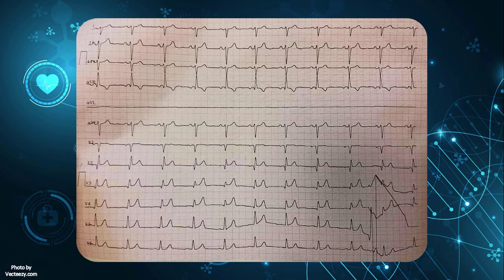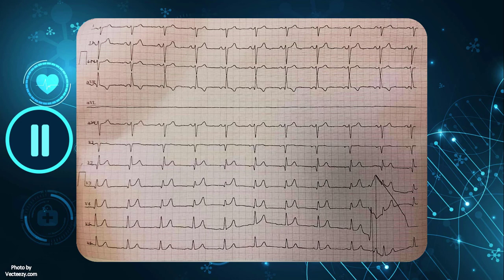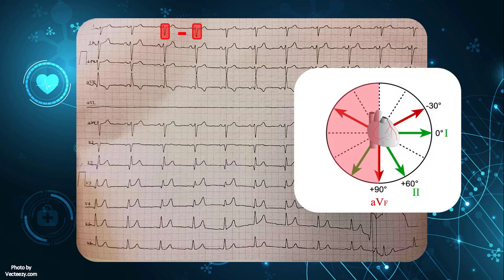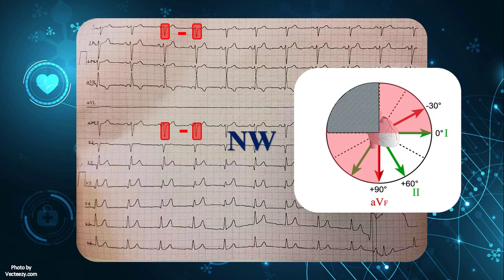In the last example, pause the video and write your own answer before we go through it together. Here, lead 1 is electrically negative. According to the three-lead method, we should now examine AVF. AVF is also negative. Therefore, northwest axis is present.